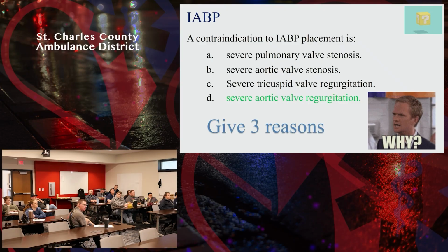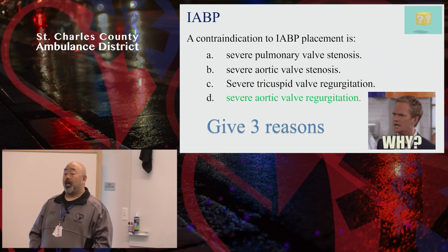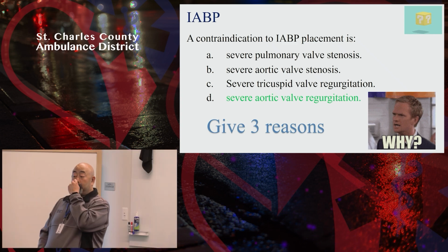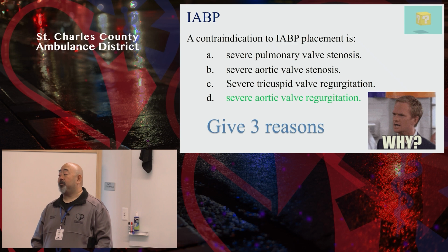That's one. What's the second why? It's counterproductive and pushes blood back into the heart. That's number two. Counterproductive. Now you're basically forcing blood back into the left ventricle, and you're overloading the left ventricle, which is not what we want to do. Okay. What's number three? Pulmonary edema. I'd say that's not wrong. Yeah. There's another reason specific to the balloon pump.